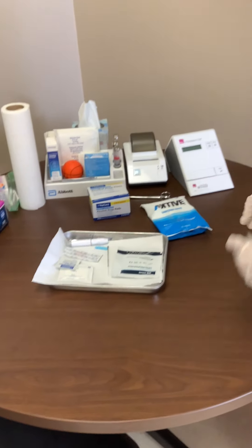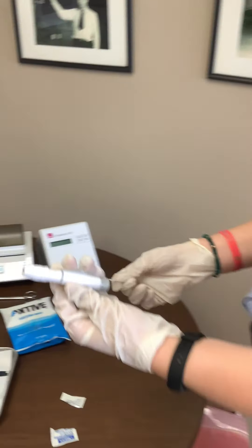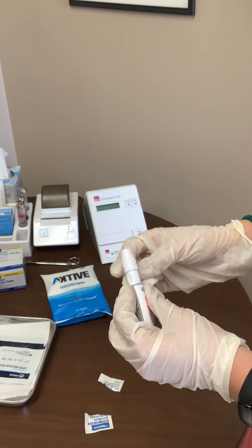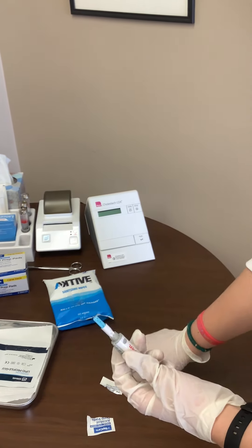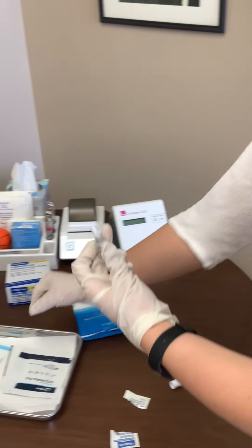You'll have that ready, and then I like to prepare the lancet before the participant gets here. I always clean it off with an alcohol wipe first, and then you just twist off the top. There's already a sharp in there, but we're just going to throw it away just to be safe.